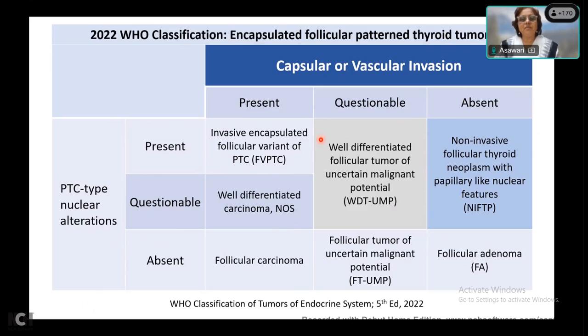Refer to this diagram. Look at this. And one person can answer. I want to know whether you can see this diagram, this table, or not. Yes. Yeah, go ahead. This is invasive encapsulated follicular variant of PTC, right? Yes, ma'am.